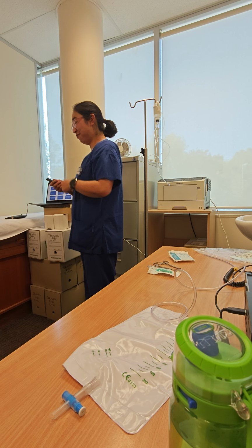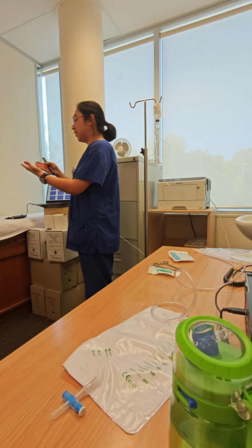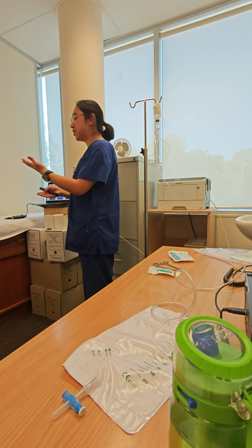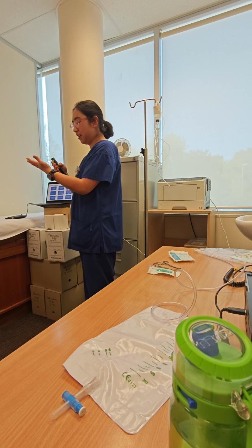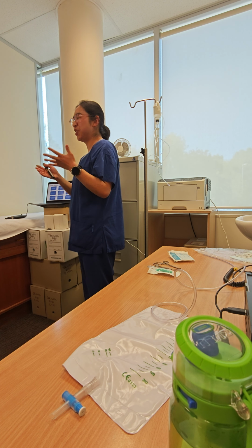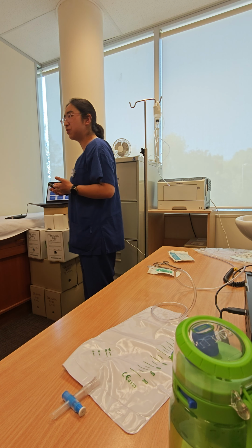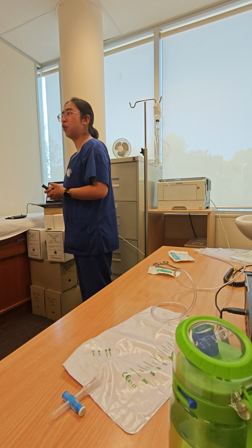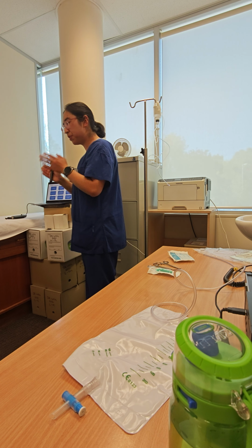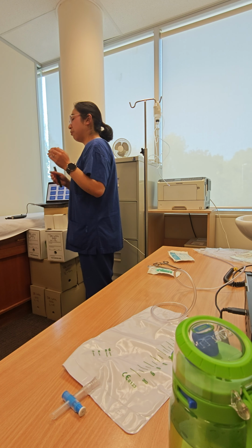So we have a look at the first time. We noticed that he had a contrast dye injection before in a CT scan, and there was no allergy and no side effect reaction. Very good. That means he probably has no issue with the contrast this time. But we still need to go through all the questions on the form every time to double check he is going to have 100% safe use of contrast this time. If that's good, we go to the next step.